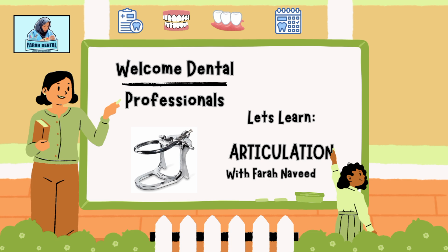Today, I am describing content on Dental Articulator, in which I select the Non-adjustable Articulator, which is also known as the Hinge Articulator. It is commonly used at undergraduate level in dental colleges and also in dental laboratories.